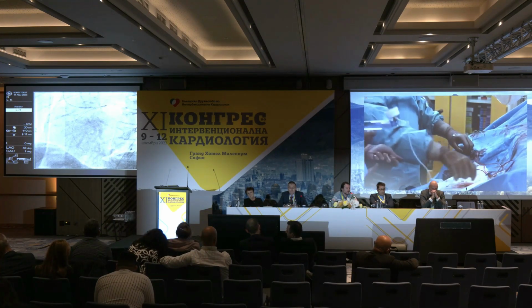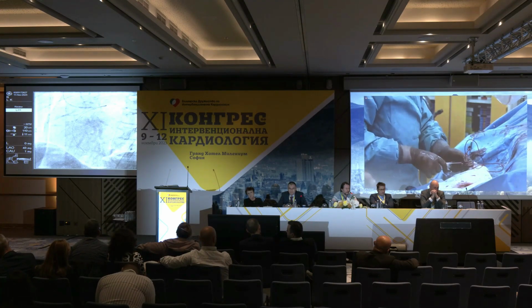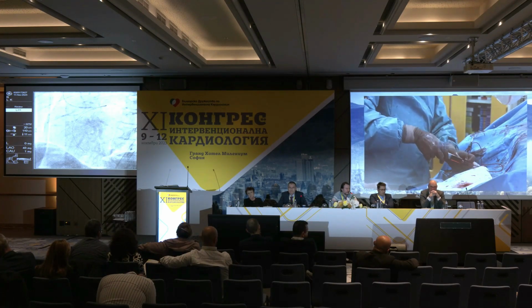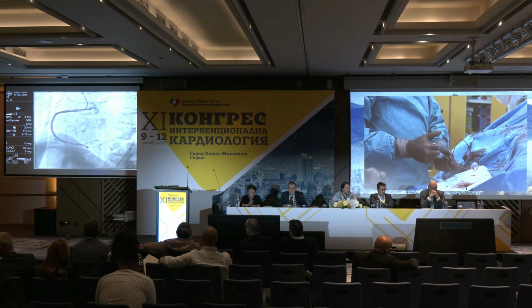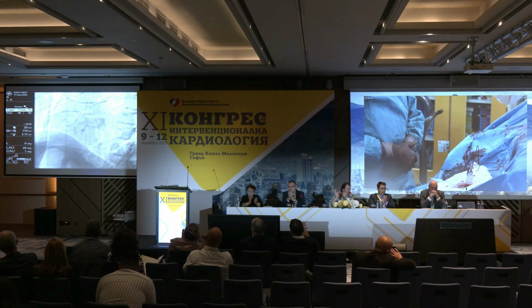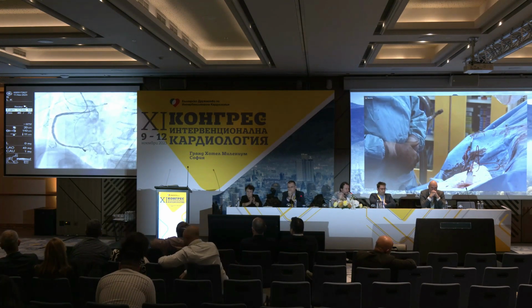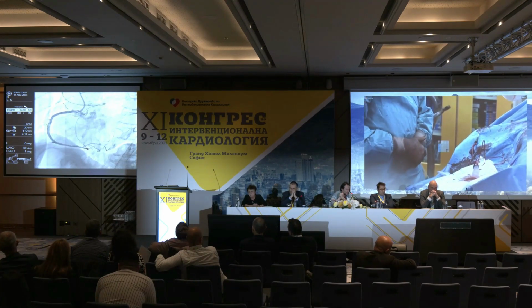Okay, big balloons. Let's de-air well, because sometimes there is. And let's see what we have achieved here. Excellent result, as always. Thank you. But there is a leak. You can see it, huh?